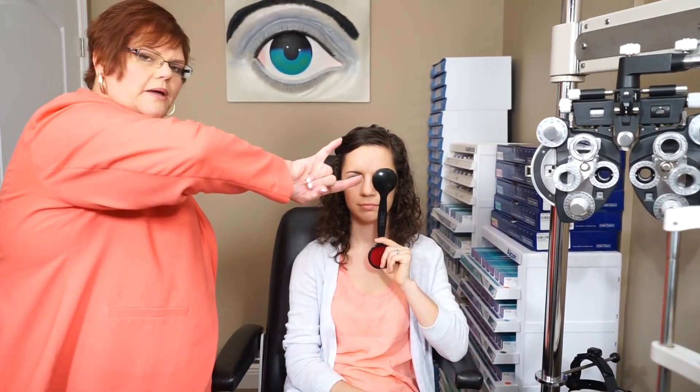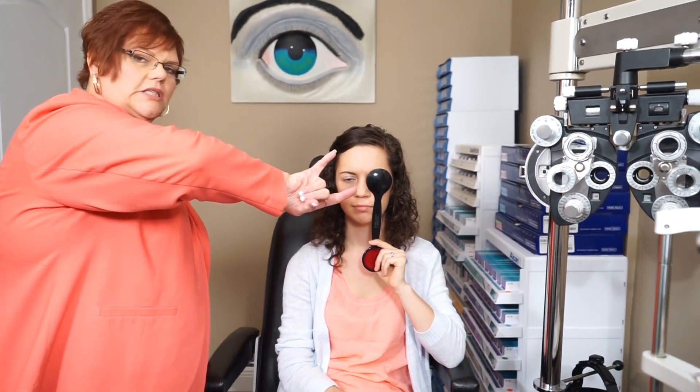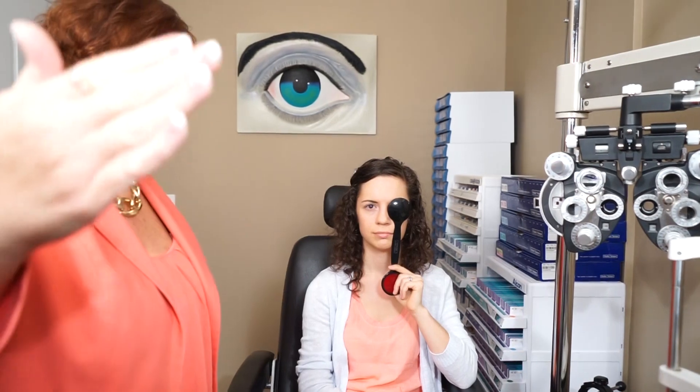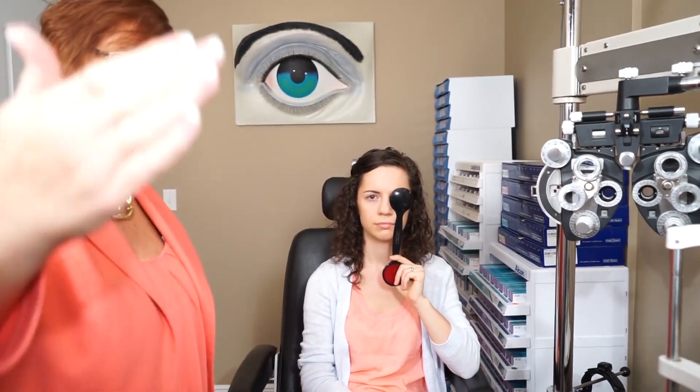If I get all the way up to her eye and she still can't count my fingers, then you go to the end of the room and test for hand motion. Ask the patient, 'Can you tell if I'm moving my hand up and down or side to side?' If they can tell you which direction, it's recorded as hand motion at however many feet away you are. If they can't, move closer until they can.